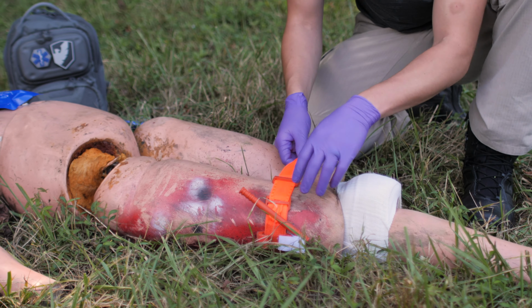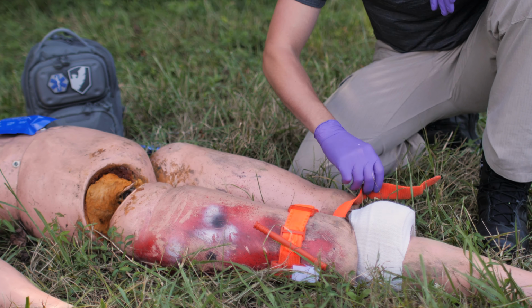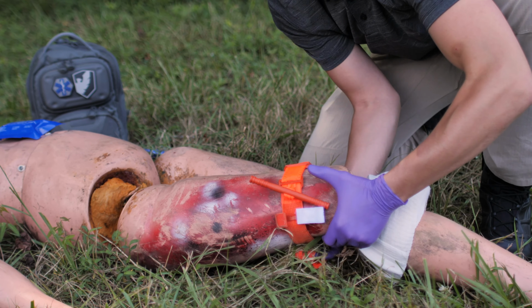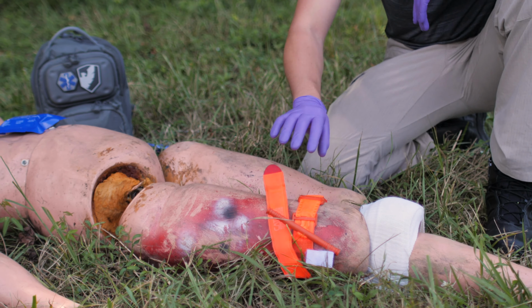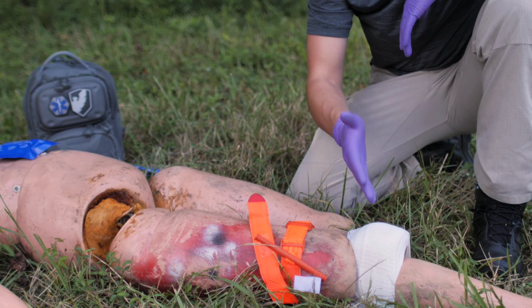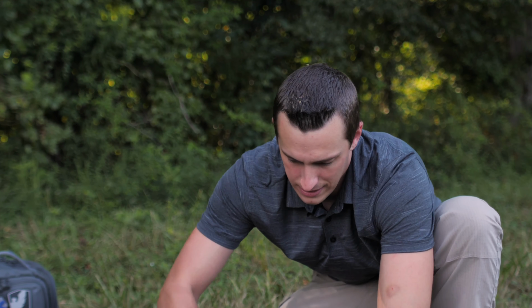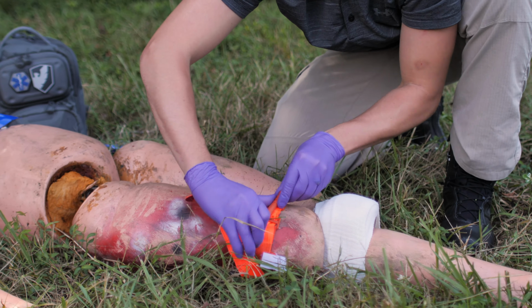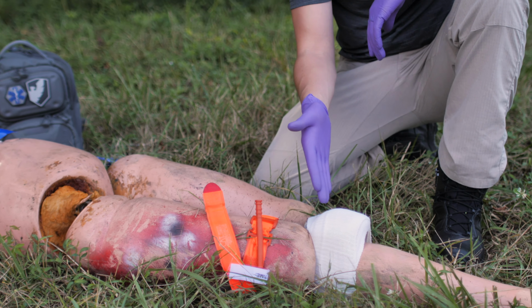So we're going to go up here. I'm going to put it on. And I'm going to leave this fairly loose. I'm going to put that in place. We're going to leave that there. I'm gonna go ahead and attach this Velcro so that it doesn't get pulled off. Leave this Velcro here. But this way now, if something happens to this wound packing, I can quickly come in here, crank this down, lock it in place, and now we've got the tourniquet back in place if this falls.